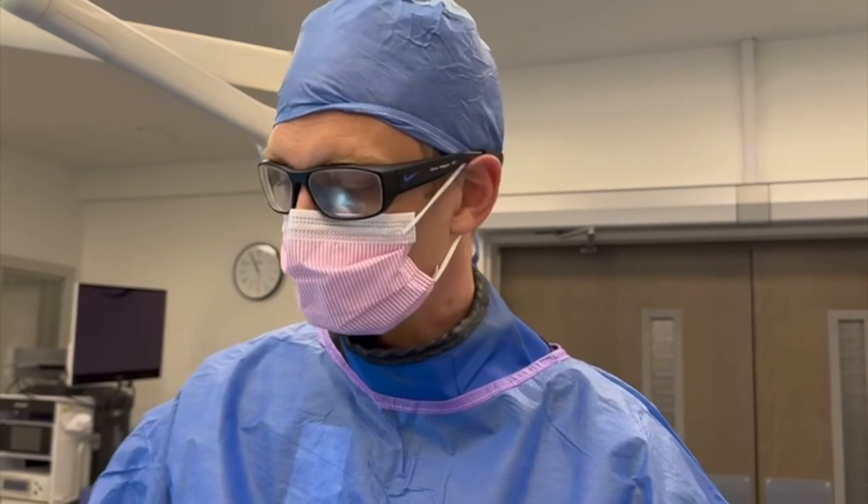My name is Oliver Shipper at the Anderson Orthopedic Clinic. I'm an orthopedic foot and ankle surgeon. This was the percutaneous calcaneal dorsal closing wedge Zadek osteotomy for Achilles insertional tendinosis. Thank you.